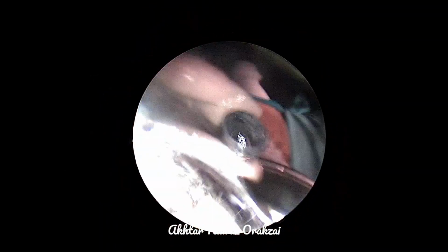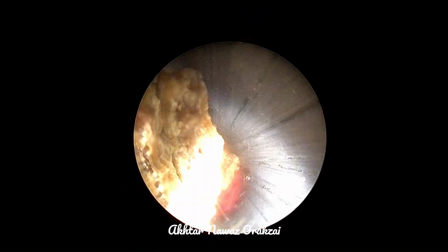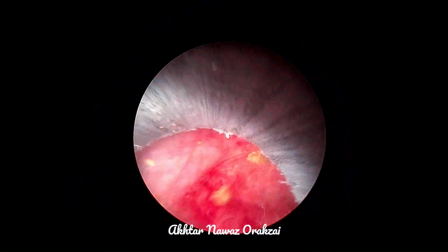So a good wash from below and a good pressure from above in the nephroscope will make the bladder filled, and the only way through which the fluid will be escaping will be the suprapubic route. So the stones will follow the fluid and hence they will be cleared from the bladder.